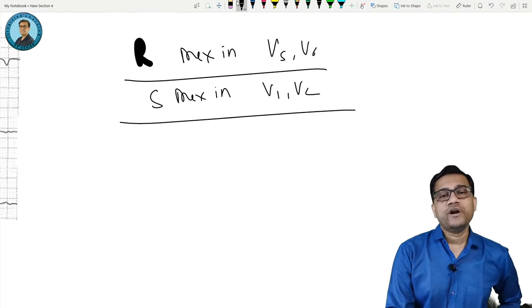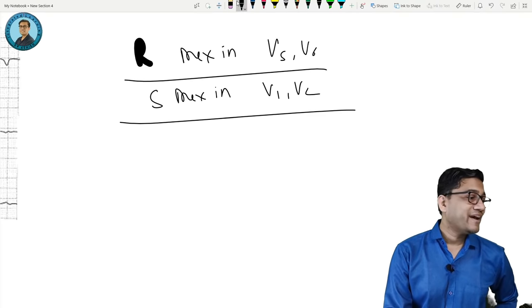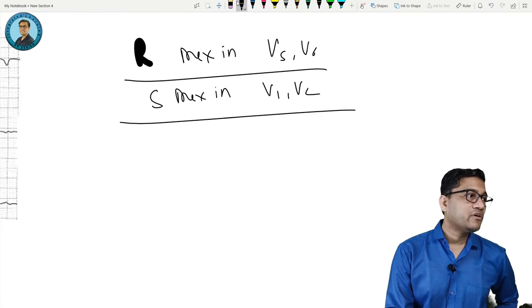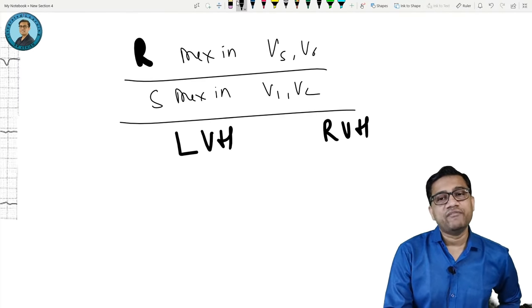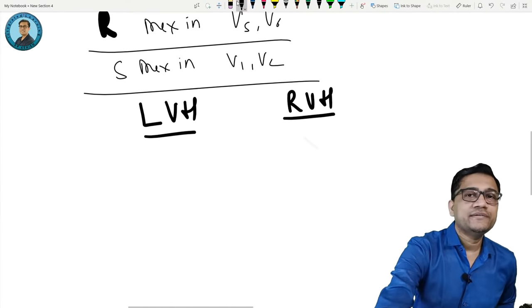One question for you: what will be the criteria for right and left ventricular hypertrophy? Let me explain. For LVH and RVH, we have criteria. So what are the criteria? Okay.